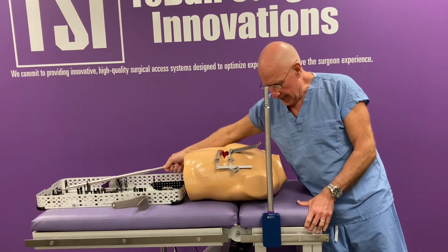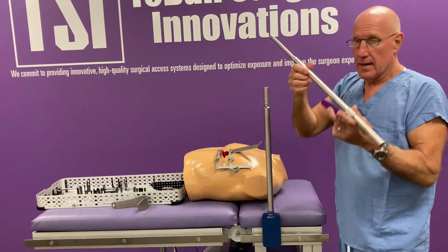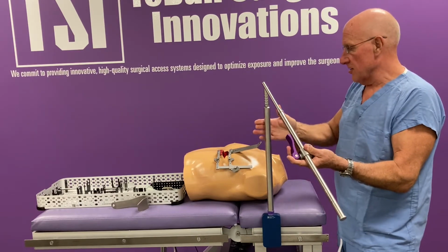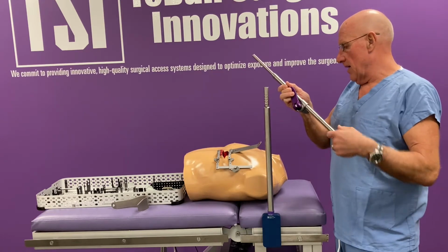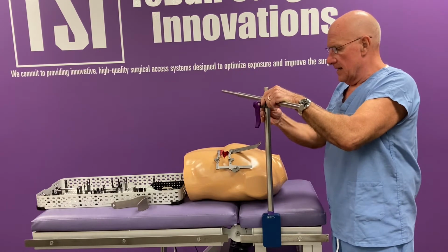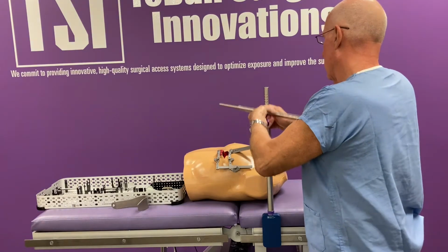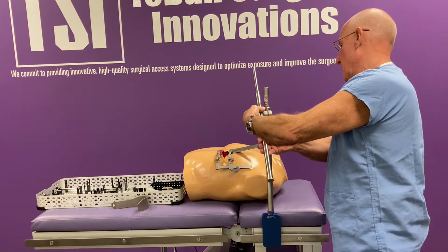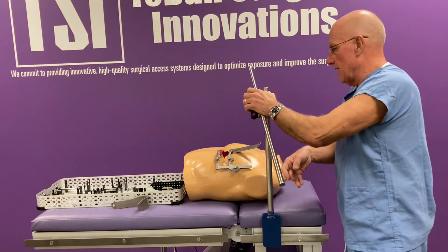Then we're going to go ahead and position the extension arm. Again, it's 2 diameters. Now this could actually be mounted across the table from the patient, but we're going to go ahead and mount it in an orientation so that it will be able to lift this. So we're going to put it here on the table arm, and we're going to get it to where the lift mechanism will be at a high enough point, and I'm guessing that's at about the right spot.